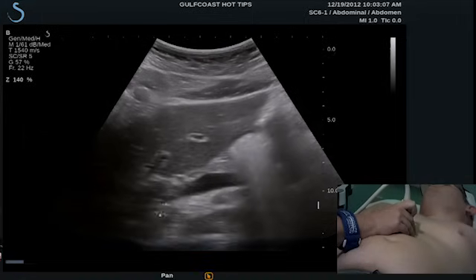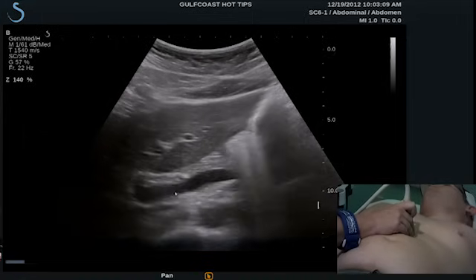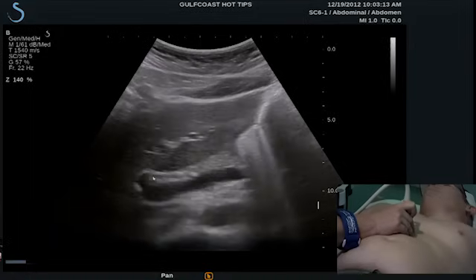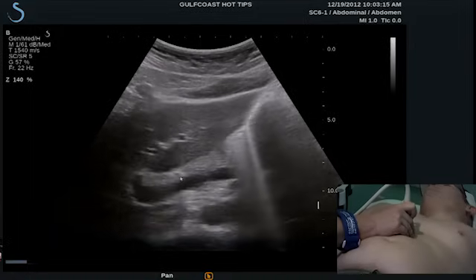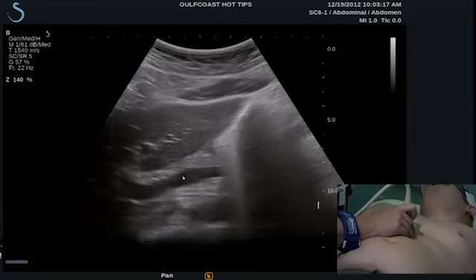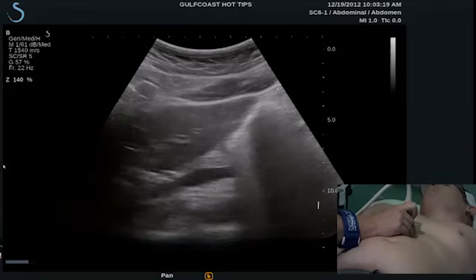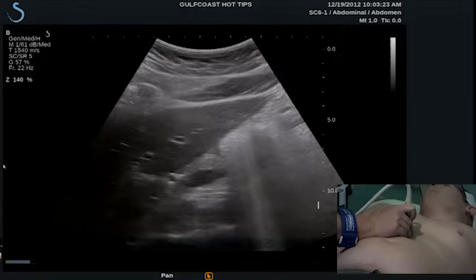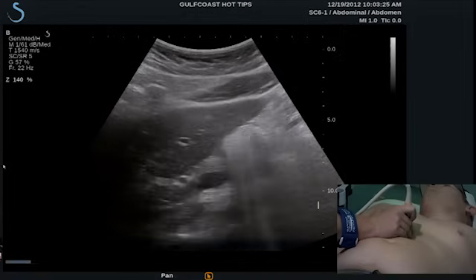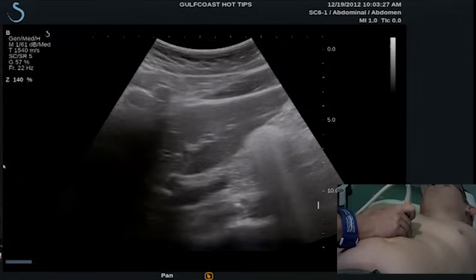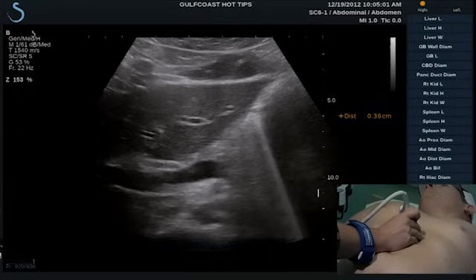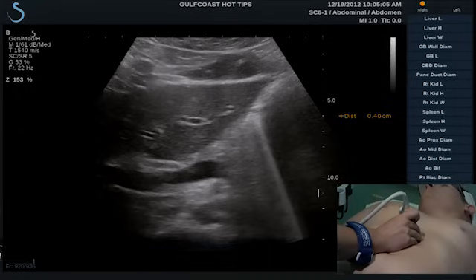What we see here, most posterior, is the portal vein, and just anterior to that, I can appreciate this small structure coming out of the liver and coursing to the pancreatic head. Remember, to elongate any structure, you need to make micro rotations with your probe to fully evaluate the length of that individual structure. To measure the common bile duct, remember you're concerned with the inner-to-inner diameter of the structure at its widest point.